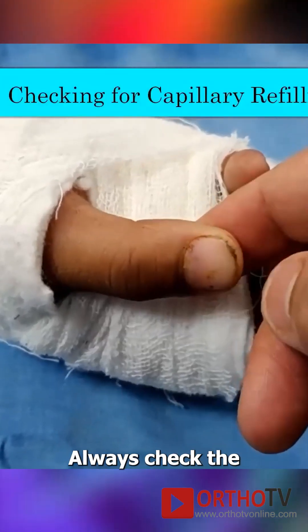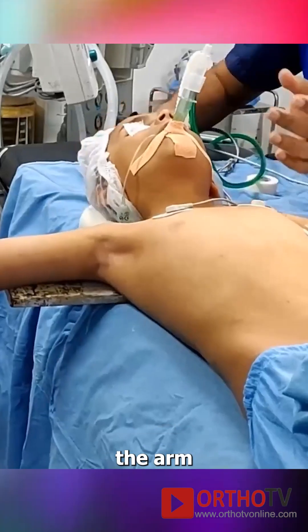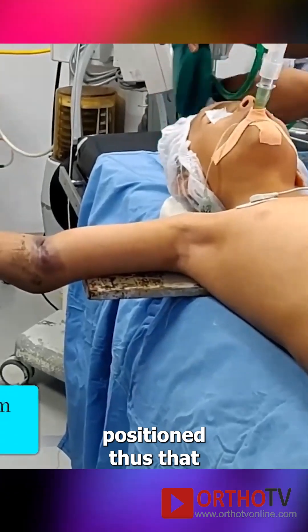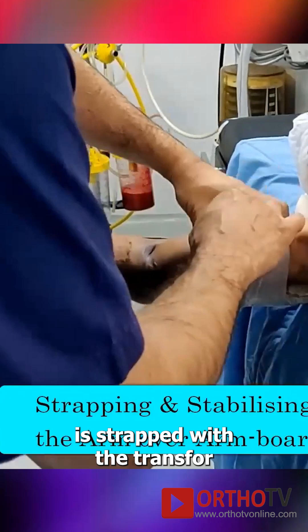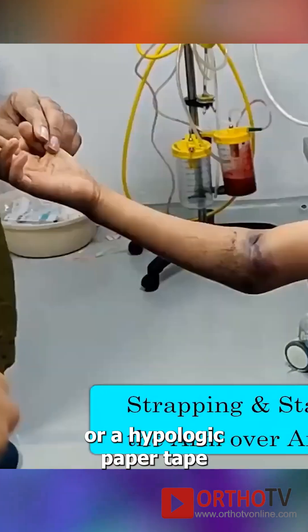Pre-operatively, always check the capillary refill. The armboard is positioned such that the proximal fragment is strapped with a transpore or a hypoallergenic paper tape.